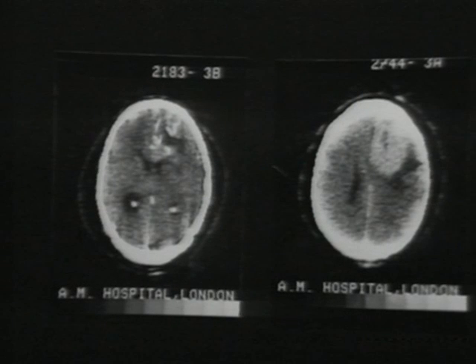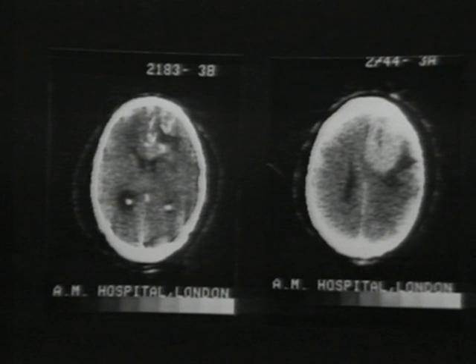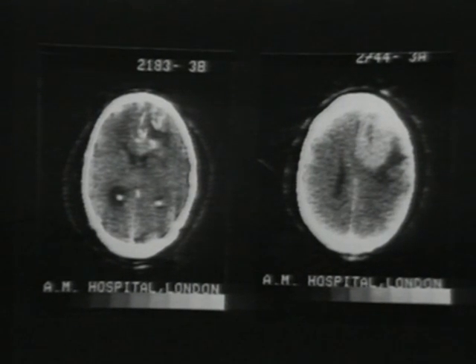Now, high absorption values may arise out of deposition of calcium in different types of lesions. It may also arise out of low water content in a closely knit or fibrous structure, or to a hemorrhage in which clotting has occurred. Low-grade astrocytomas, oligodendrogliomas, or ependymomas are examples of neoplasms which show up as white areas in computerized scans because of their calcium content and consequently high absorption values. The calcium aggregates may be in psammoma bodies or calcospherite formations.